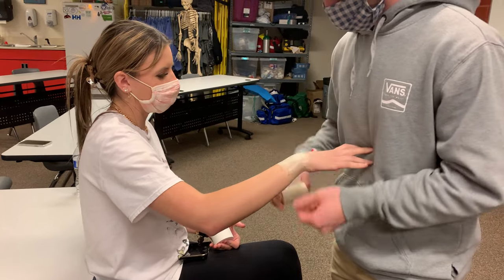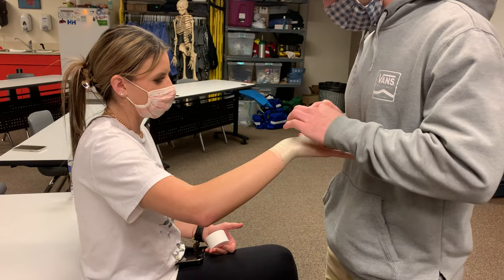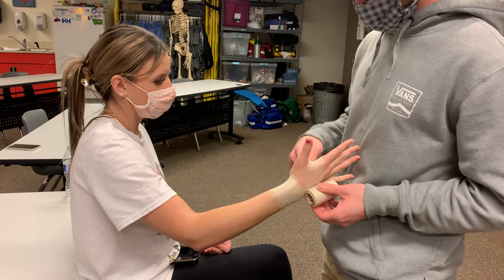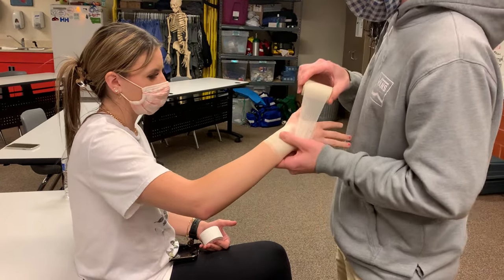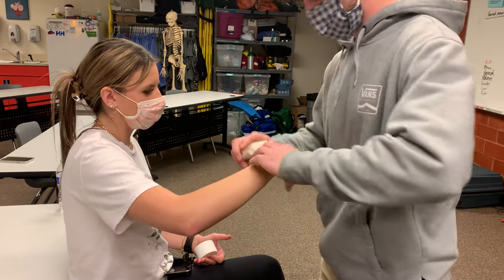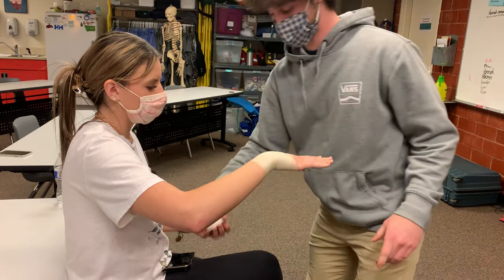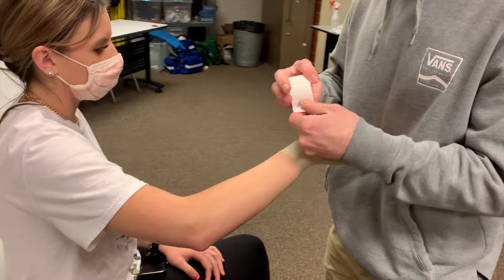Holding it flat, you want to go inside of the hand, inside the thumb, then go around the thumb and back around this way, making sure to cover a good majority of the hand and finishing right back there at the wrist.